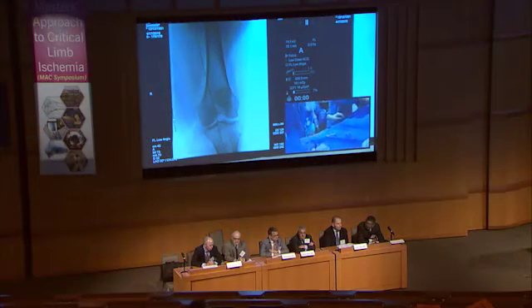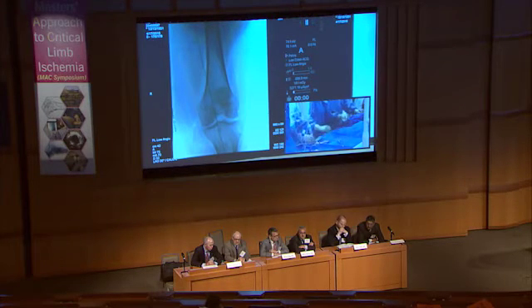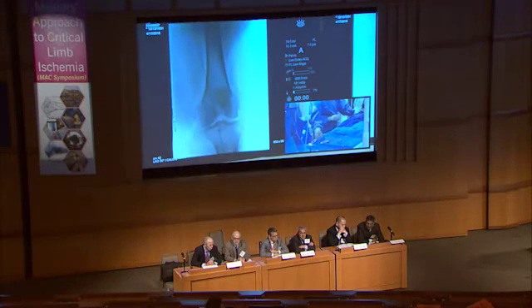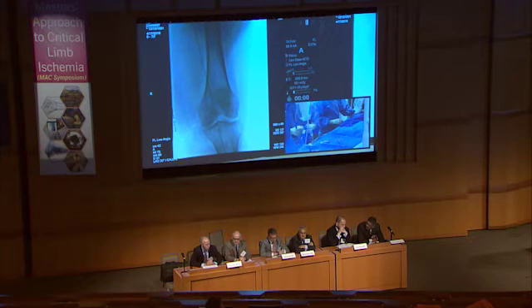The fistula is definitely of significance at the moment, because in the last image we could nicely see the venous return flow down to the calf level. So this is probably the main reason for the swelling of the patient. So both have to be fixed, the arterial occlusion of the SFA and the fistula as well. John, your comments. Mehdi looks like has already crossed it. So your comments regarding the strategy and also how would you finally treat it?